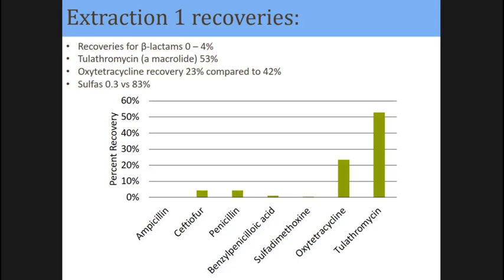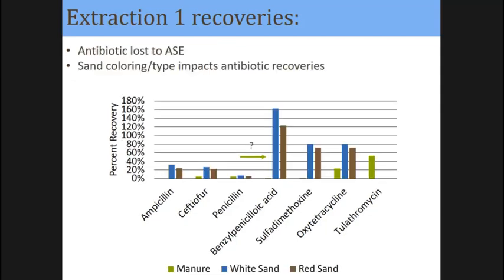This is obviously not a standard protocol, right? I mean, I did it to the T, and I did it twice. This is only the second time that I'm showing you. And so we also took through this just spiked manure, spiked sand. So like the sand column process, we just spiked some 1 ppm of antibiotics, just to the top of the sand to see. It was just QC.